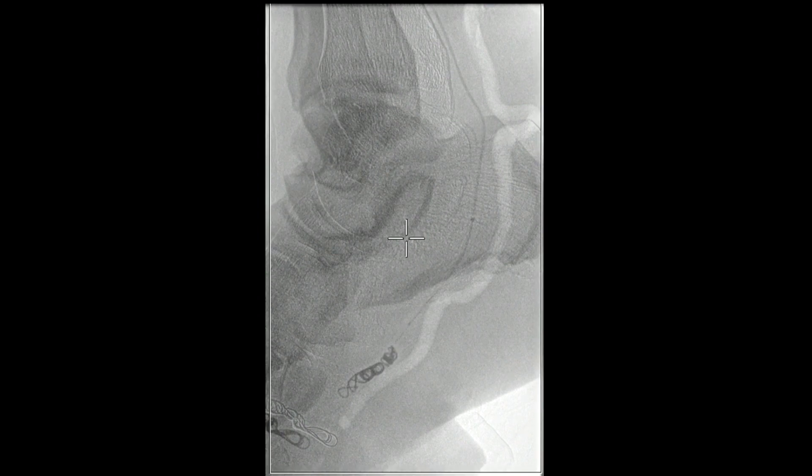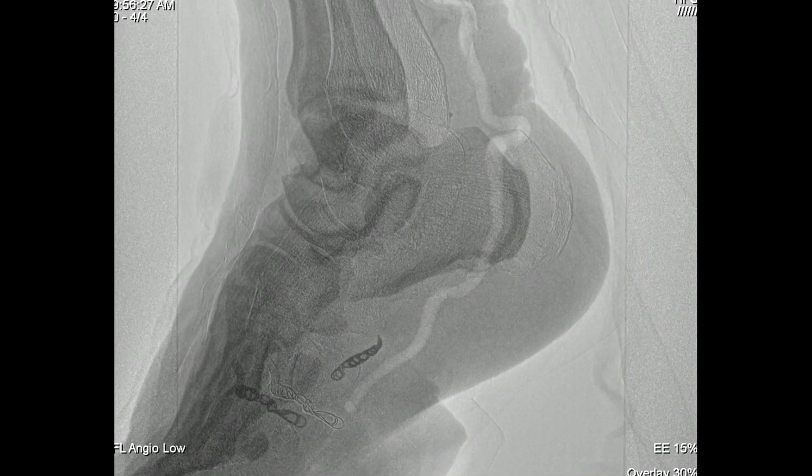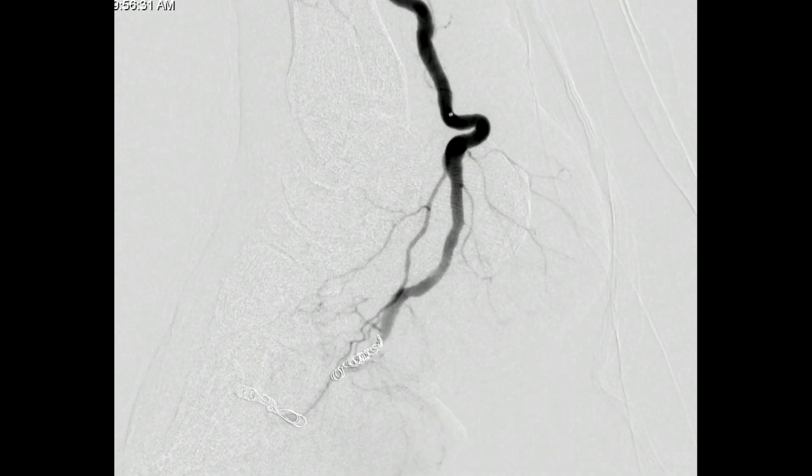There was enough landing zone here — a nice long length — so it was relatively safe without risking interference with other branches. We started with a combination of 5mm and 6mm interlock coils and packed them with 3mm coils. The nice thing about these interlock coils is they have a lock, so you can deploy them and confirm occlusion. Here it looked like it was occluded.